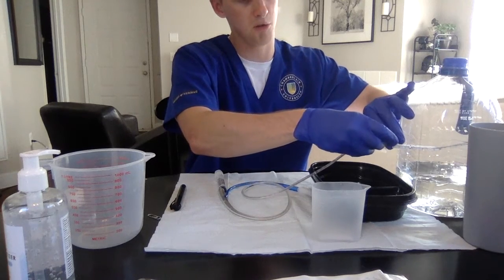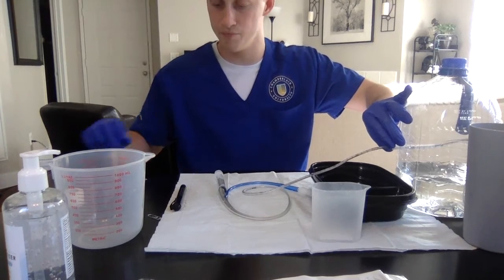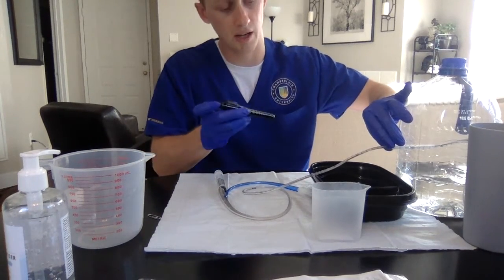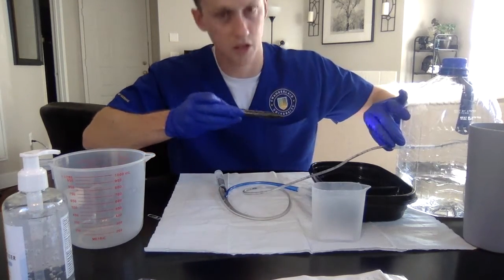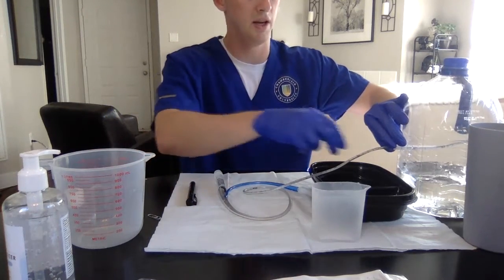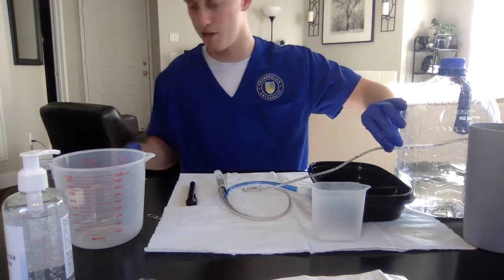So now we've reached this marker, so I'm going to remove the tape so it doesn't go into the client's nose. We're also going to use our pen light. We're going to have the client open their mouth, make sure that the tubing isn't wrapped around their tongue or anything. And then now we are going to secure it to our patient's nose.